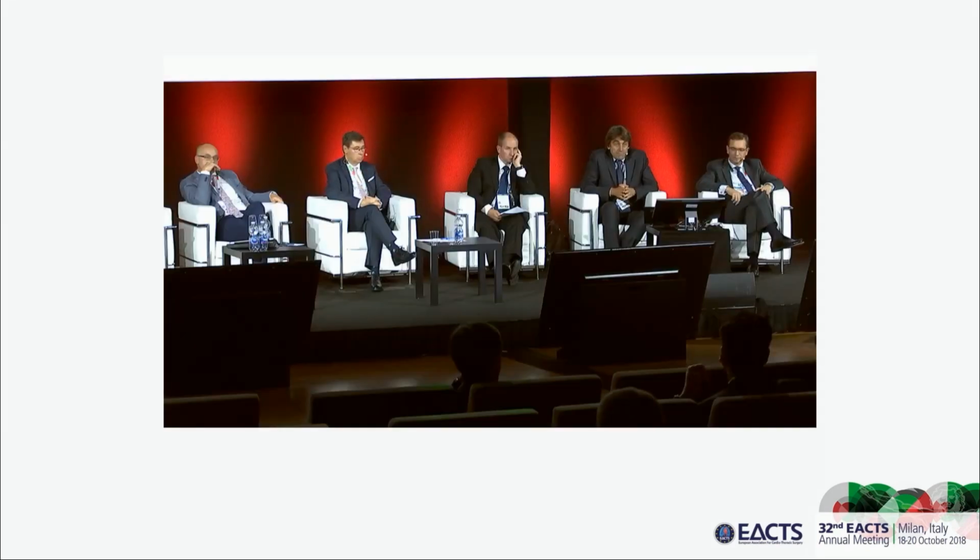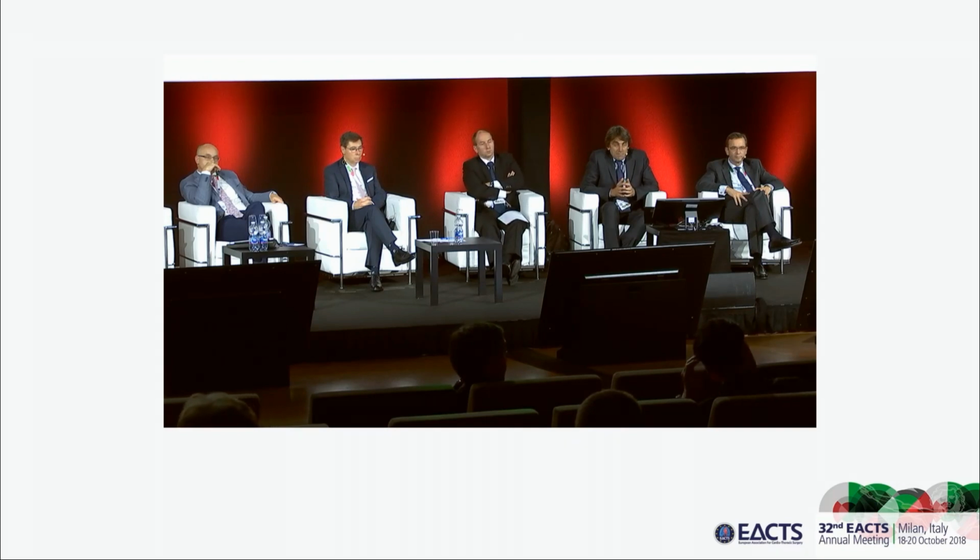I would like you to elaborate a little bit more on external annuloplasty. Because actually there is one weak side of this technique you presented. We all appreciate the idea behind the external annuloplasty, especially this is how the reimplantation technique works and is a fundamental part of the reimplantation. However, during reimplantation, we are just based on some kind of measurements.